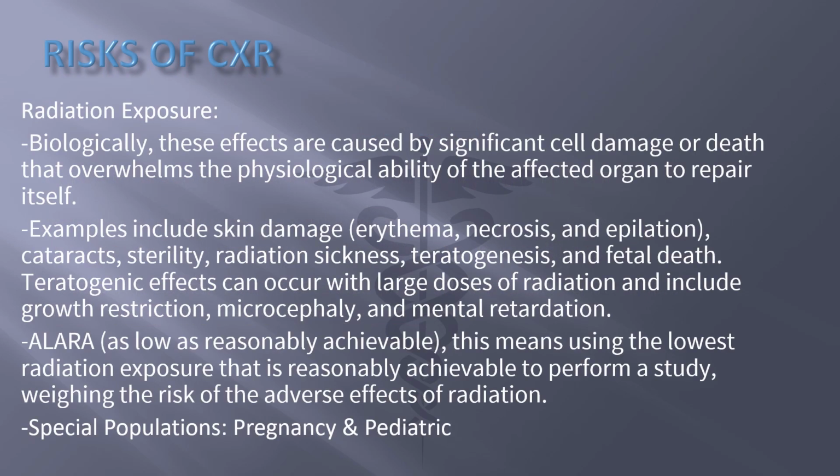Risk, of course, for X-rays is radiation exposure. These can cause biological injuries within the cells that can overwhelm their ability to repair themselves. Examples of this are skin damage, cataracts, even sterility, radiation sickness, injury to the fetus, these types of things. Excessive radiation dosing in the fetus could cause growth restriction, mental retardation, and microcephaly.